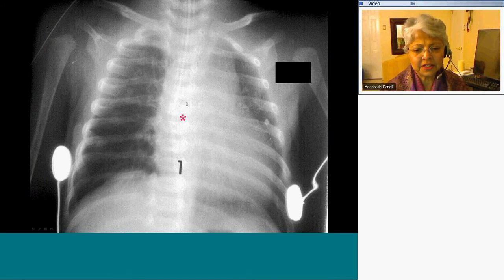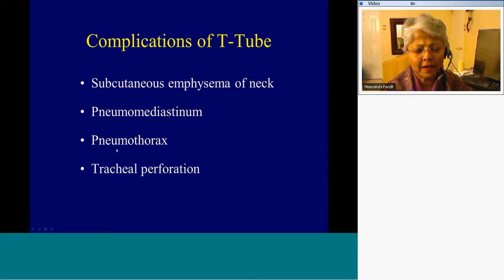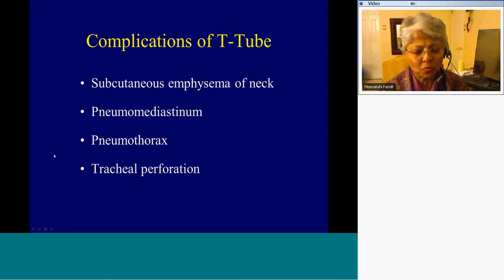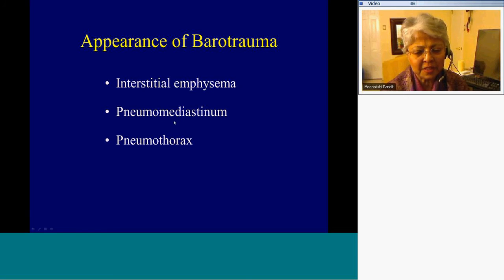This is a pediatric patient — the carina is somewhere in this location, and the endotracheal tube is clearly heading towards the right main stem bronchus, which will eventually lead to collapse of the left lung. The big complications for the tracheostomy tube include subcutaneous emphysema of the neck, pneumomediastinum, pneumothorax, and tracheal perforation, especially of the posterior wall. The radiographic or CT appearance of barotrauma includes interstitial emphysema, pneumomediastinum, and pneumothorax.